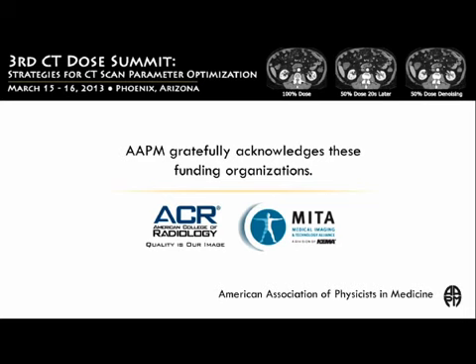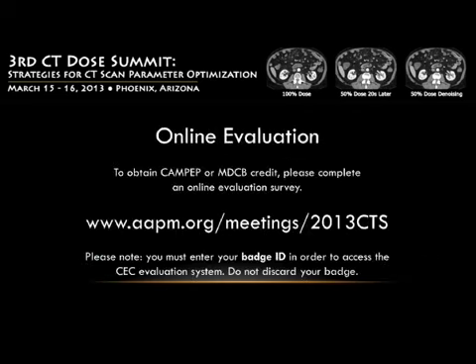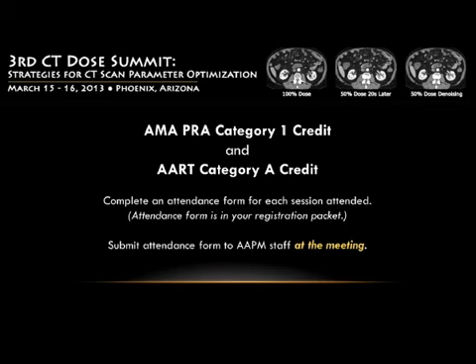We've gone back and forth with that max MA value at my institution. The applications person initially convinced me to let it go to whatever maximum it was able to, and I was having a weak moment and went along with that. Then it stumbled across a few wickedly high values on some very large and perfectly round patients, where we got beautiful images of fat, and there was nothing else in there.